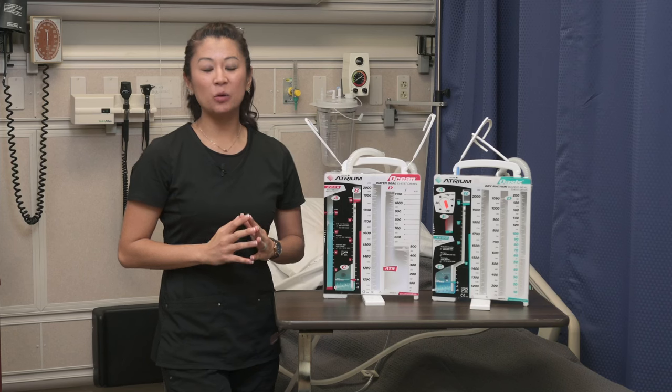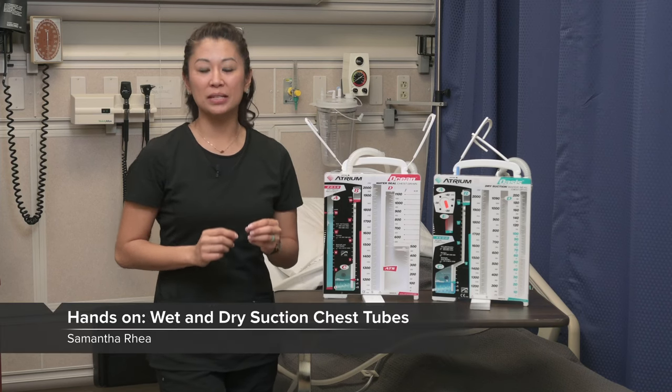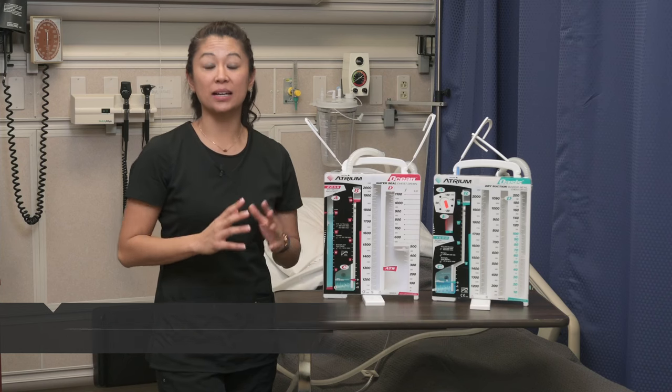Before we finish, we've had a lot of talk about chest tubes. Getting familiar with the equipment is really going to help you out, so let's take a look at that.